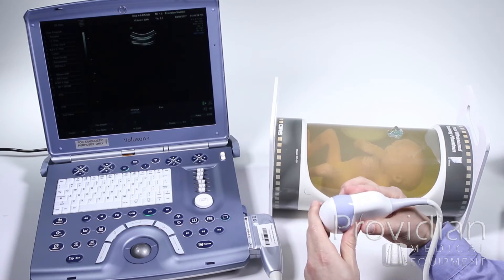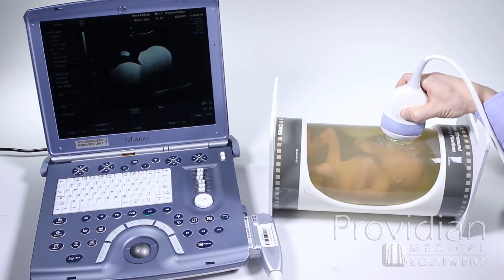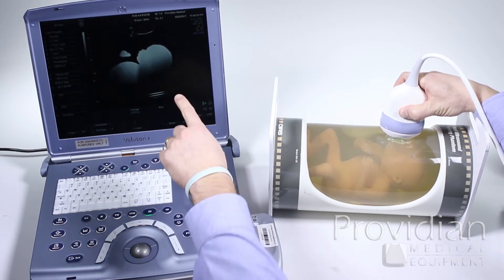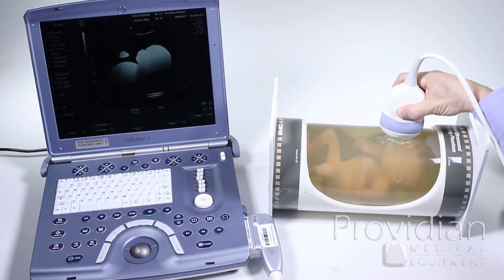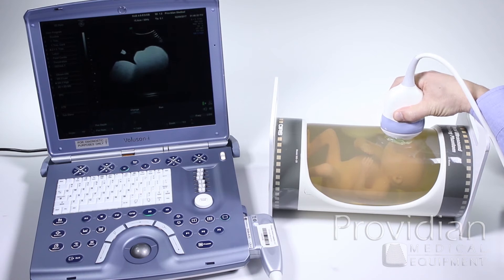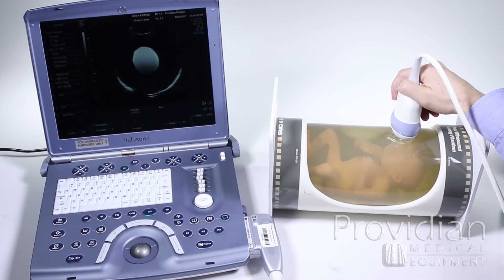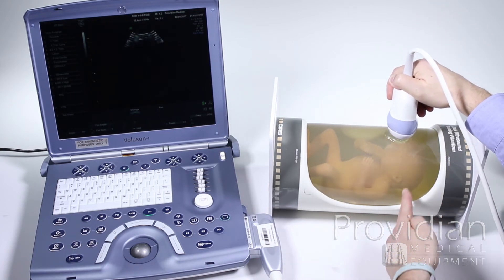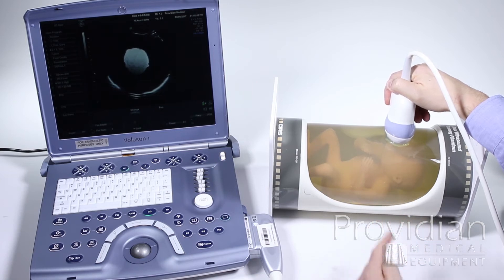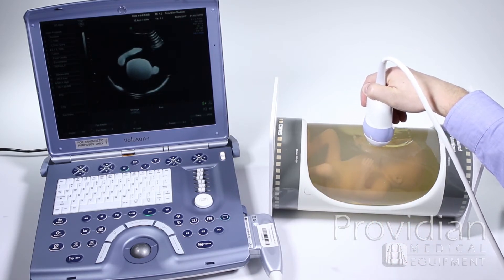We have our probe marker here. Let's say the baby is in a vertex position. When we scan, you'll see on the image that it's giving me a profile of the baby — showing the nose up. What it's actually doing is showing you a slice of the baby. Think of it like a slice of bread: the probe takes that element and shoots it straight down, giving me a slice right through the baby's head. As I scroll down, you're seeing a very thin slice of everything.